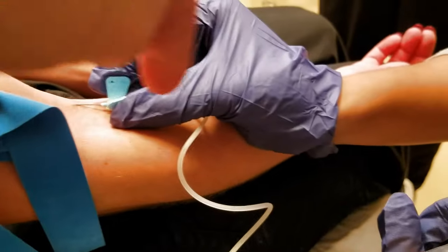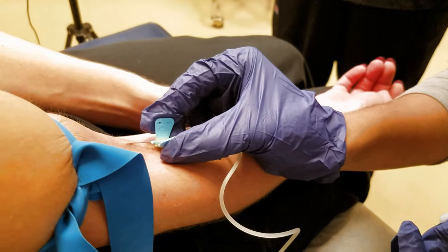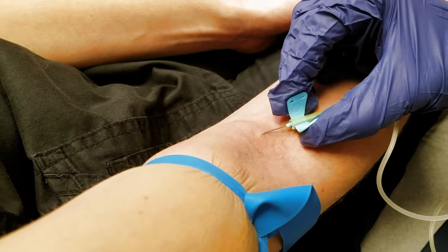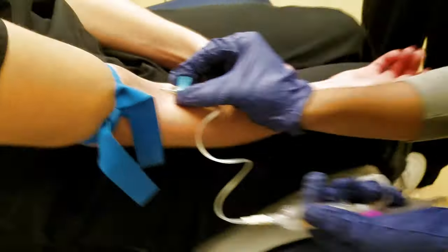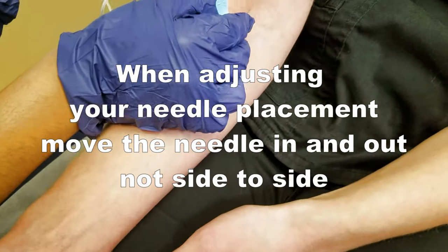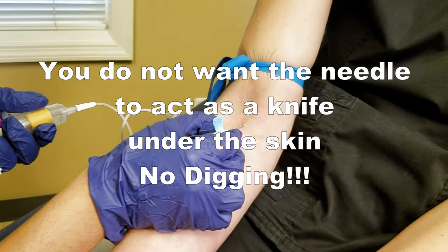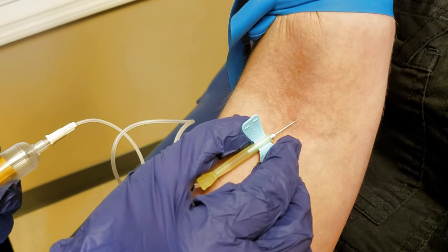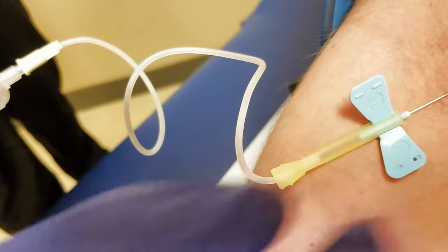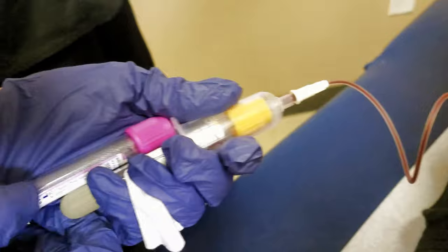The vein is going this way but your needle is going more this way. Don't turn it — almost pull the needle out but not all the way, and adjust to match the angle of the vein, then poke again. Pull out slightly and aim towards here. Tilt your hand out — keep going — there you go, now go. Look, you've got some blood coming out. Let go with your right hand, gently, slowly, and push your tube in. Now it's filling up.